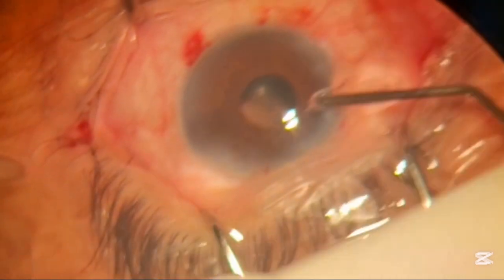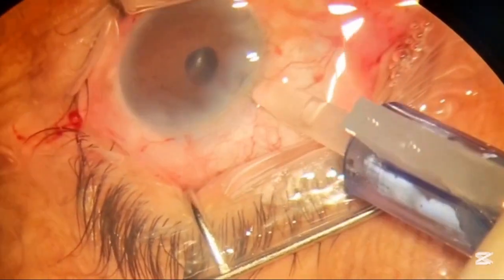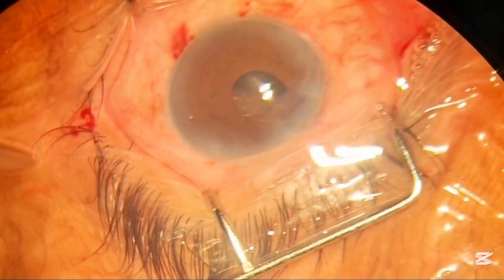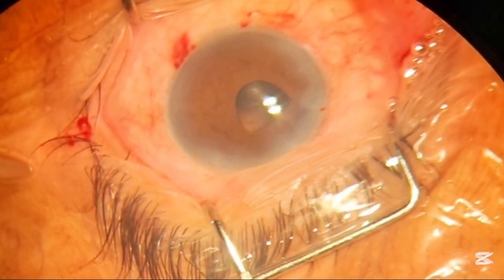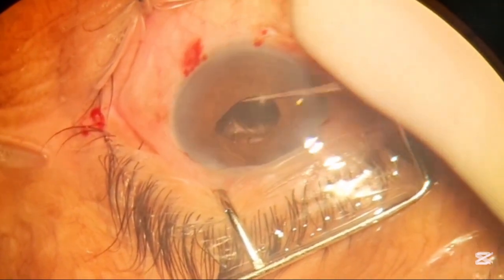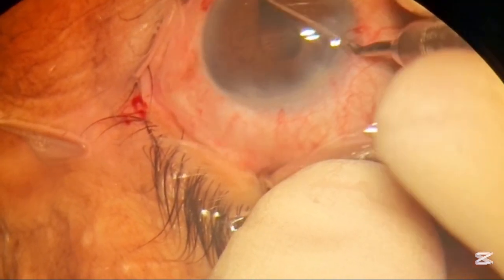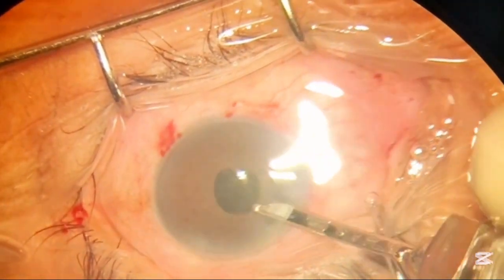After removing all the lens matter, we put some gel in to deepen the space. You can see the pupil is now smaller than before. We are using a foldable intraocular lens in this case. We try to insert as much of the optical component into the pupillary margin as possible to guide it into the bag, using a little dialing and pushing backwards, then placing the haptic into the bag. Now it is totally in the bag.